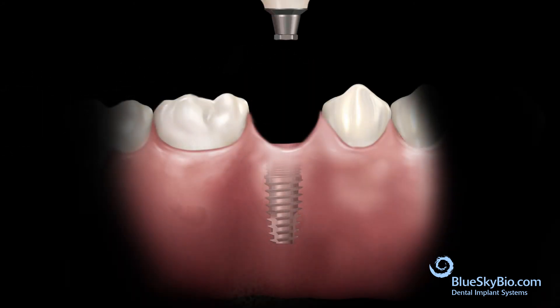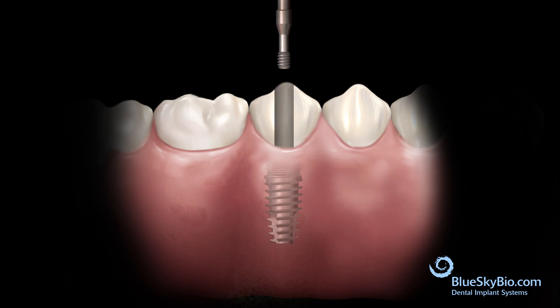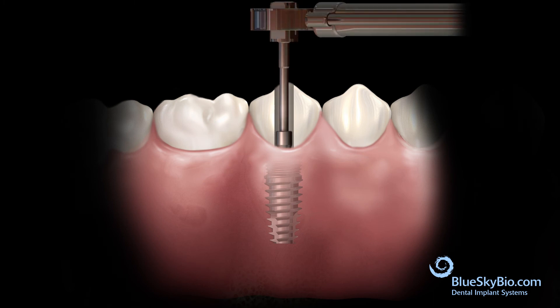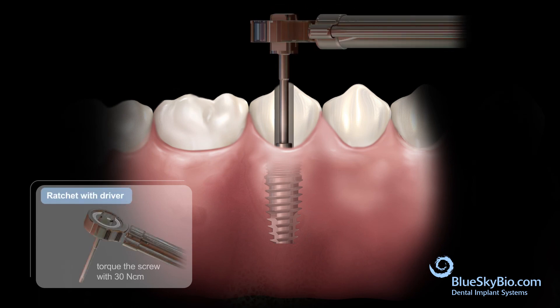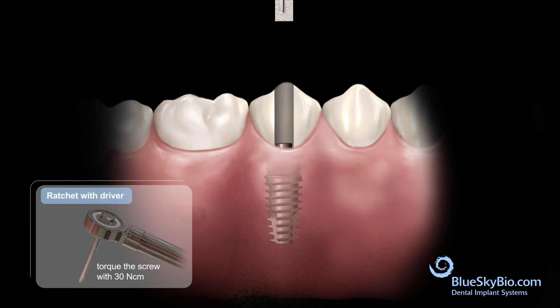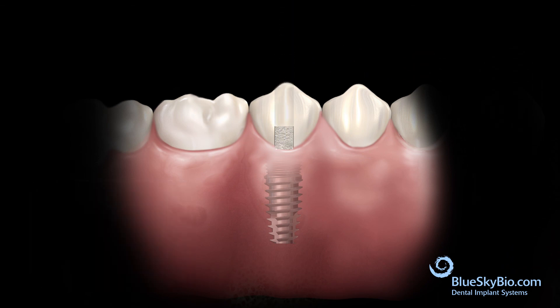Remove the crown and abutment from the analog. The restoration is seated and the screw is inserted and torqued to 30 newton-centimeters. Insert a cotton pellet into the screw access hole to protect the screw, and fill the hole with composite.